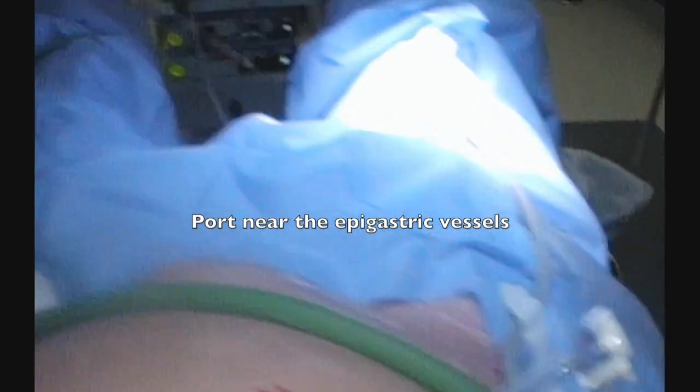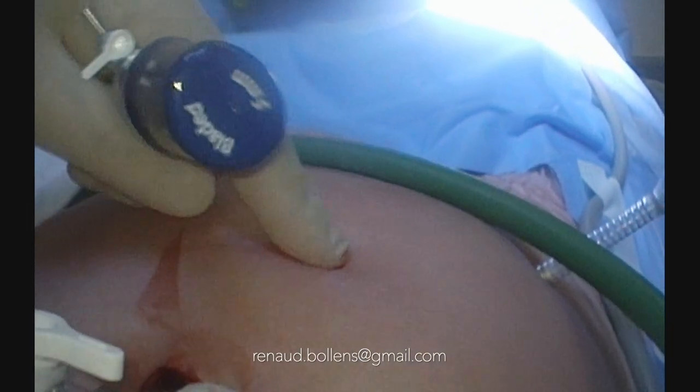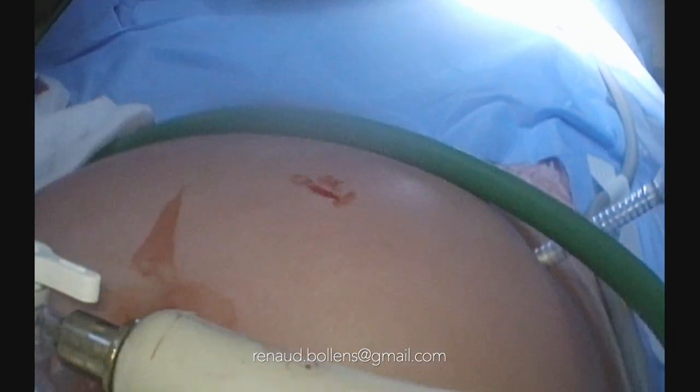And this is the incision that I did on the skin. And I know that just vertically under that one, I'm on the epigastric.